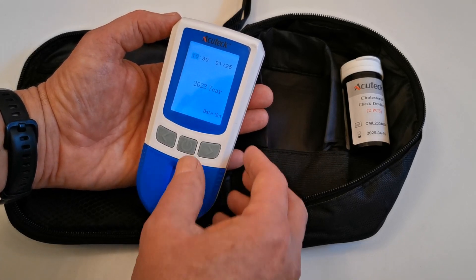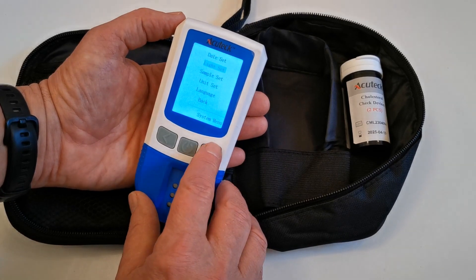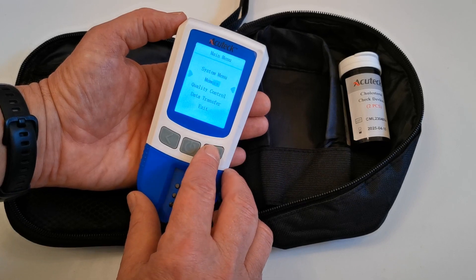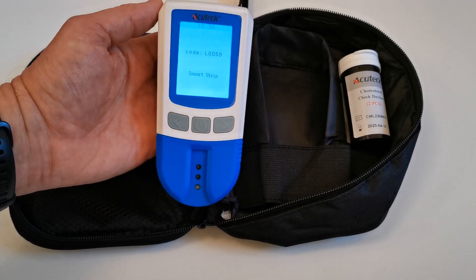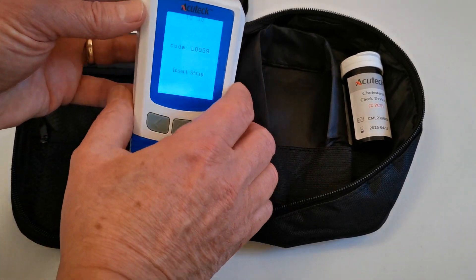The other way of getting out of this menu is to hold the power button down and navigate down and out of the menu using the back buttons and the exit button. Once you've completed that for the first time, you have completed setting up the meter.